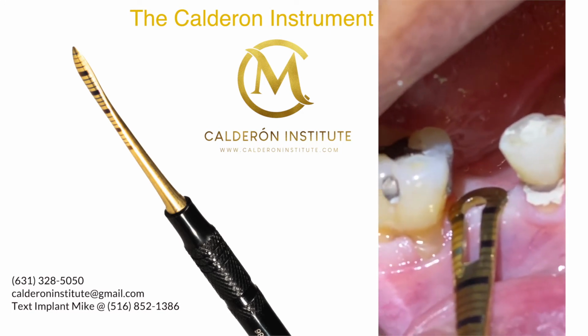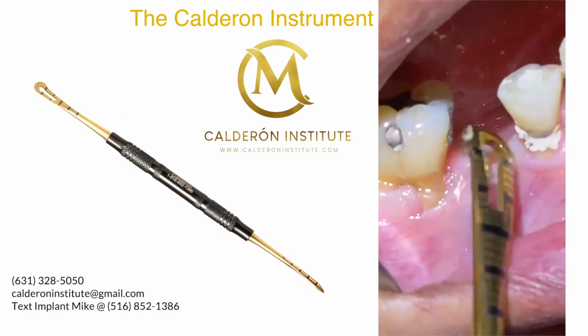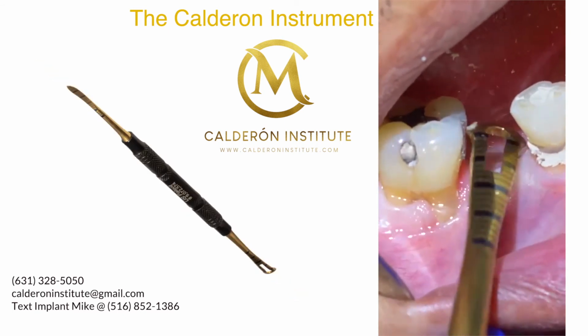I can put it at the end there. That's the ridge, 6 millimeters. G, can you see that? Yeah. That's how wide this ridge is right now.